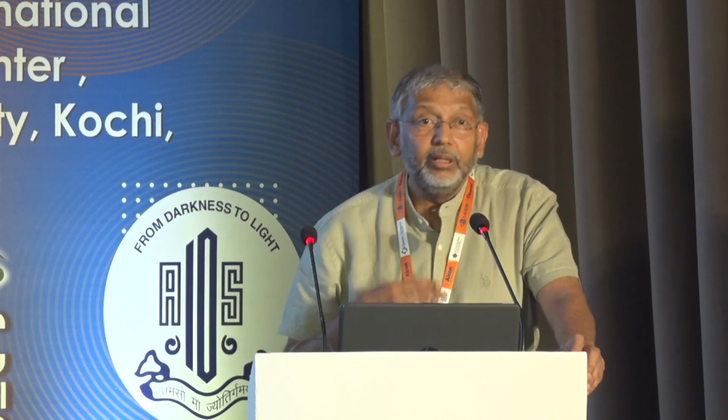If there is a high angle alpha, consider a monofocal IOL. As she already told, don't try to put a multifocal IOL. If the angle alpha is not high, then we have to analyze the corneal aberration with Chang analysis, and DLI. I'll come to this later on in the last talk.